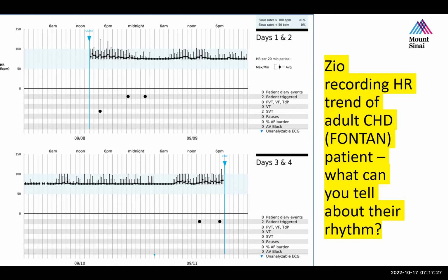Well, maybe because it's not sinus rhythm. Maybe it's an escape junctional rhythm, for example. Okay, accelerated. It could be a junctional rhythm, but are junctional rhythms that regular? I mean, you could almost take a ruler on this heart rate line and draw it right across. That's the most reliable junctional rhythm of all time. Yeah, much more common explanation would be a pacemaker, probably.